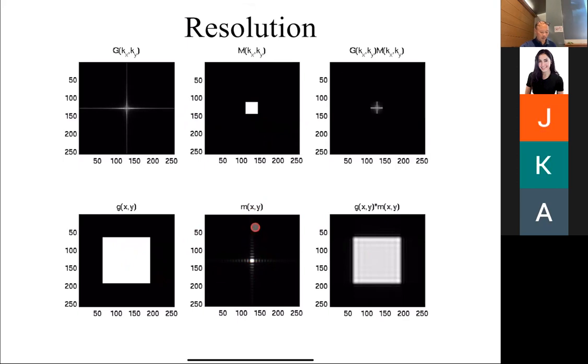I think in your first MATLAB problem, you convolved it with a Gaussian function. And if you convolve it with a sinc function, you end up with this. So you get some blurring. You also see these sort of artifacts, right? Those are the zeros of the sinc function. So there's obviously a trade-off, right? You're not collecting as much data, but your image doesn't look as good. Okay, so the question is, how much data? What should the size of this rectangle be?